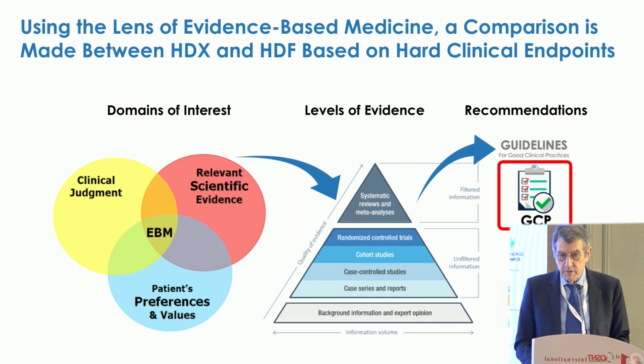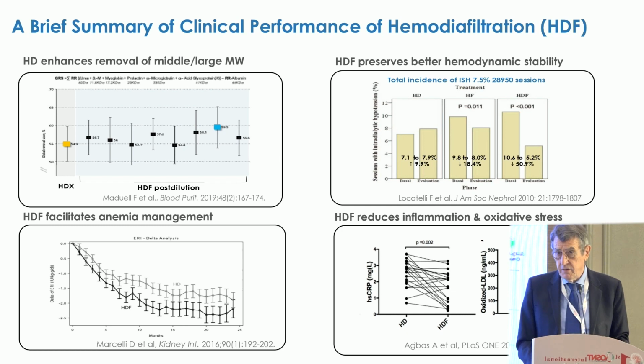I put that in perspective of the domain of interest, which are the scientific relevance from the studies, the patient preferences, and the clinical judgment. And of course, we know we have the guideline. This is a long way to come with the hemodiafiltration. I just put a brief summary of clinical performances. So this is not our endpoint.